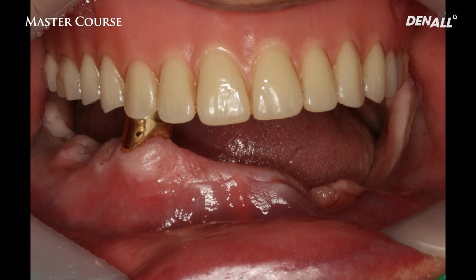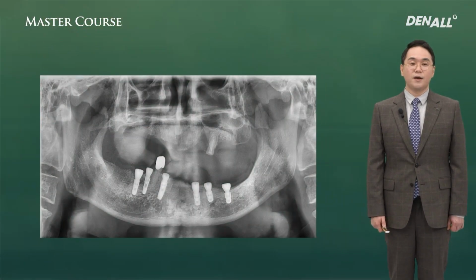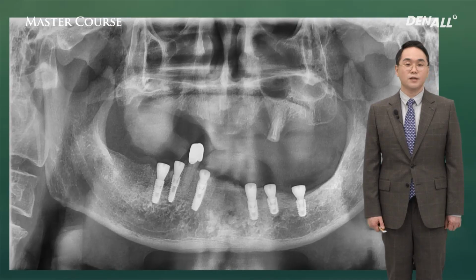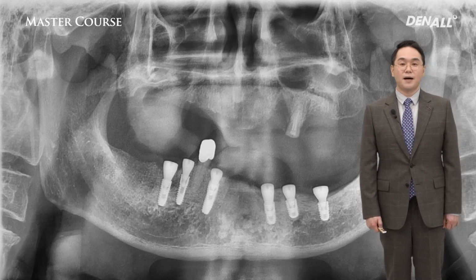One guide was planned. Planning was done. The guide was fabricated. 3 anchor pins were used to fixate the guide. In order to prevent any gap with the gingiva below, it was fixated tightly to minimize tilting. As planned, 6 implants were placed. I decided to keep number 44 because there was no major mobility. As anticipated, implants were placed nicely.